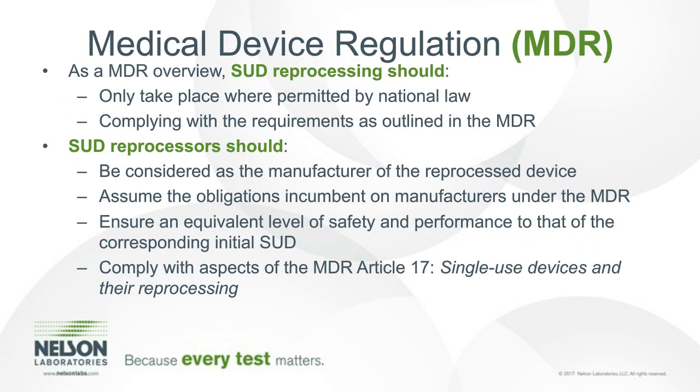Looking at the MDR, prior to the 2017 revision of the MDR, the European Union did not have policies in place governing the reprocessing of single-use devices. With the latest publication, the MDR now has defined a regulatory pathway for the manufacturing and reprocessing of single-use devices. This regulation now allows a reprocessor to align their practice with a regulatory document to demonstrate their products are as safe and as effective as the original device, and thus meeting the same regulatory requirements as the original equipment manufacturer.